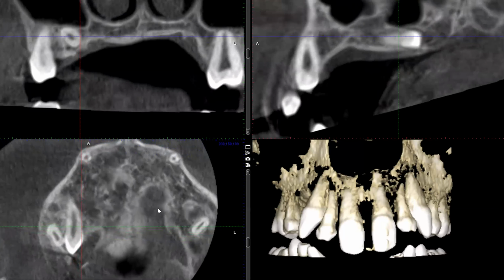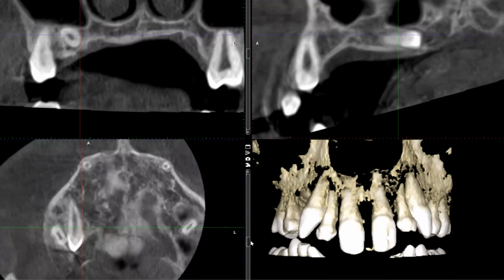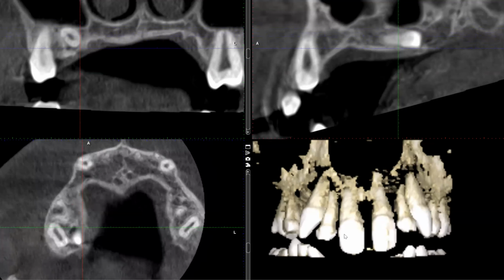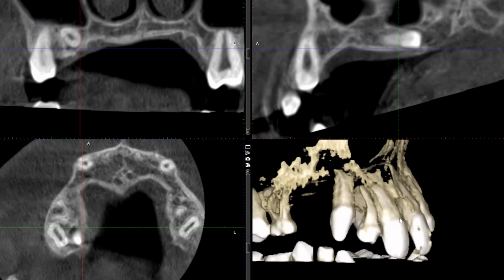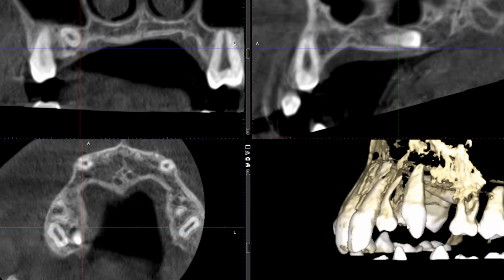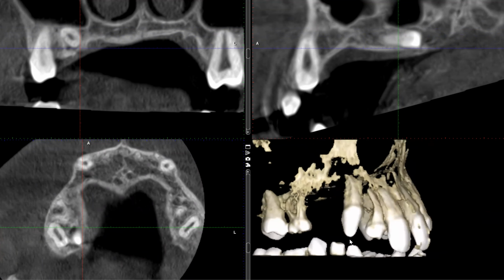So at this age of 14, we're missing quite a number of permanent teeth as well as over-retained primary dentition. And last but not least, if you look at the shape of these crowns, particularly the canine, do you see that these are a little bit more conical and somewhat narrower than the traditional canines?